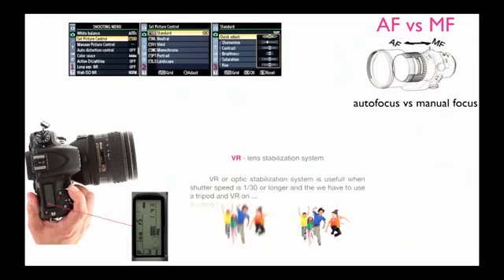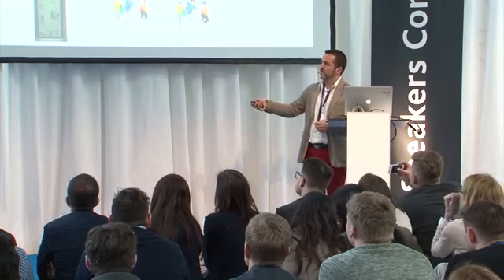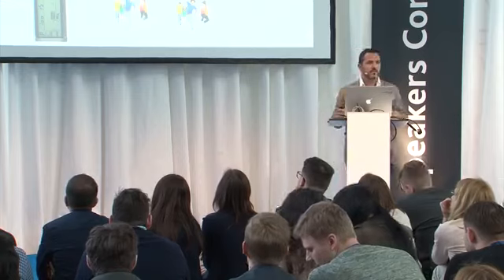Then, if your camera doesn't have this secondary screen here, it means that it's a toy camera, let's say an amateur camera that you cannot take all the way to professional level. You can do good photography with that kind of camera, but usually semi-professional or professional cameras have a secondary LCD screen. It means that it has a better sensor, a better chipset inside, and better electronics in general. And you can have much faster access to the main settings: the F-stop, the ISO, and the exposure time.